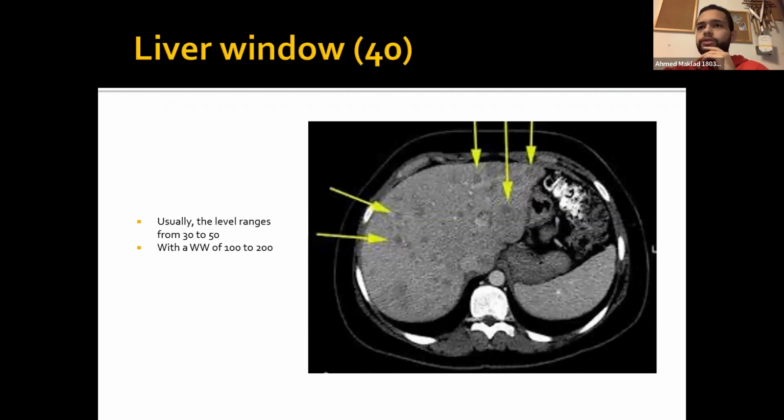No, you don't have to memorize the ranges. It's just to further explain to you how the window works, but you don't have to memorize the windows. You're welcome.